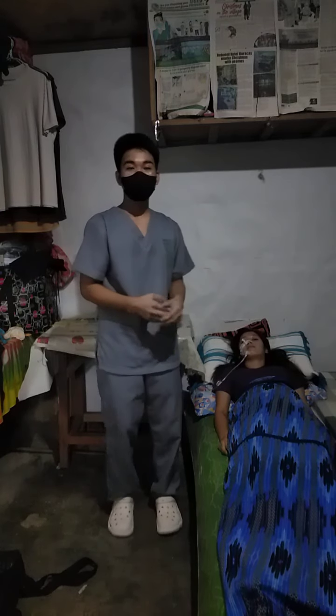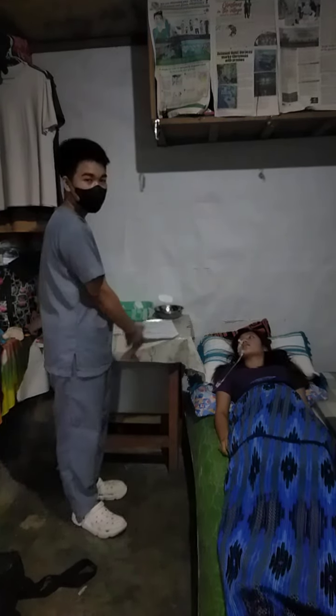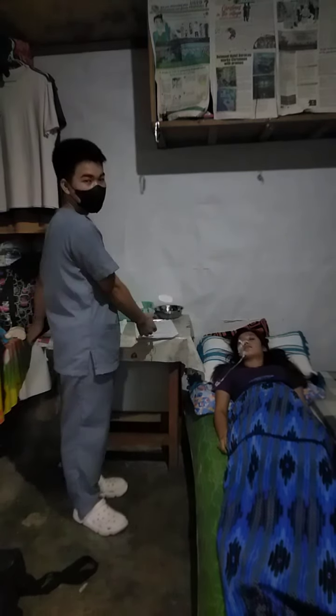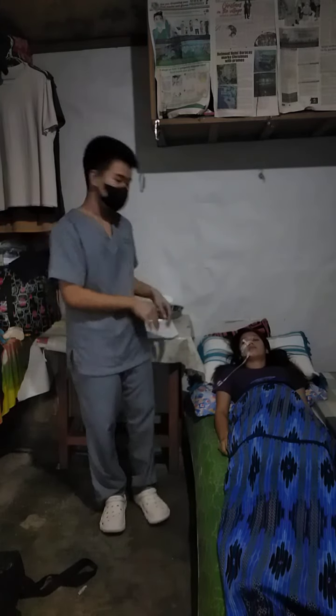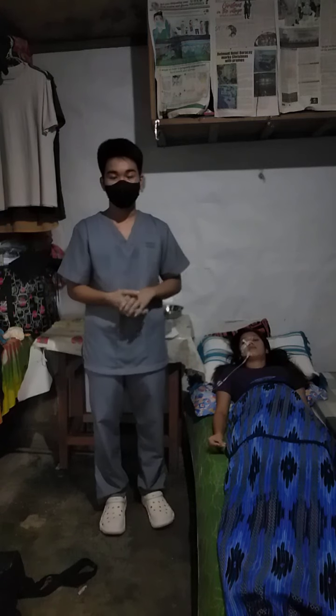Next is to assemble all equipment at the bedside. So, here are the equipment. Hand hygiene, I'm assuming that I already did that. Stand on the client's right side if right-handed and left side if left-handed. So I am right-handed, so I'm standing on the right.